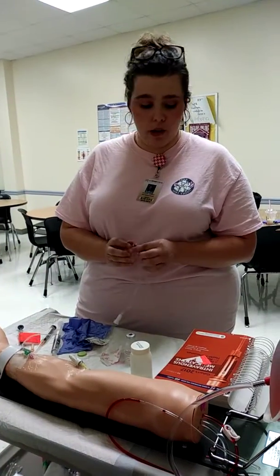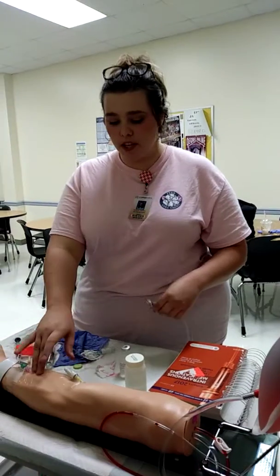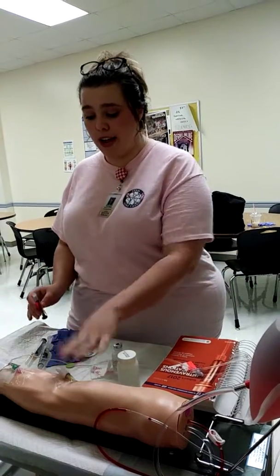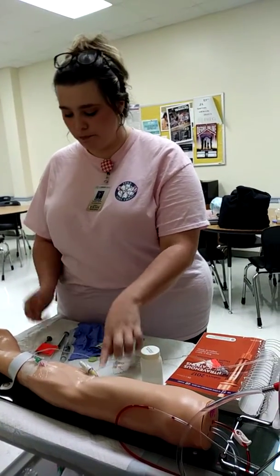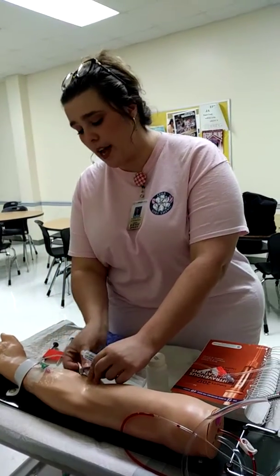I'll go ahead and unclamp the IV line. Everything is good. The patient doesn't feel any pain or burning. He's fine. Now I'll also have an order for an INT adapter. I'm going to look and make sure the patency is good on it. Everything is good. I'm going to have to flush it, so I'm going to clean the adapter.